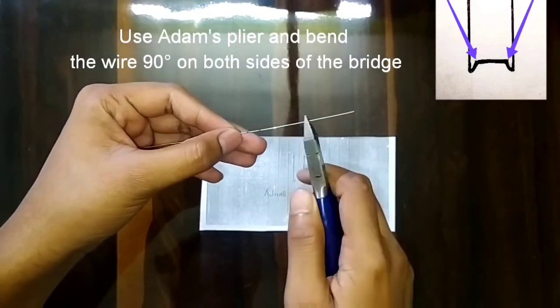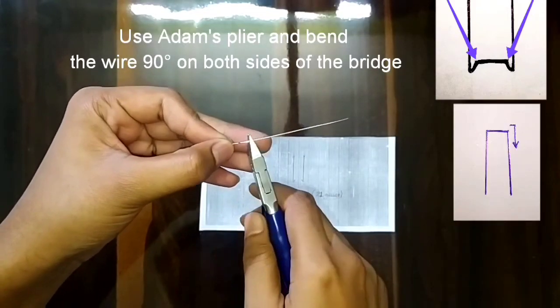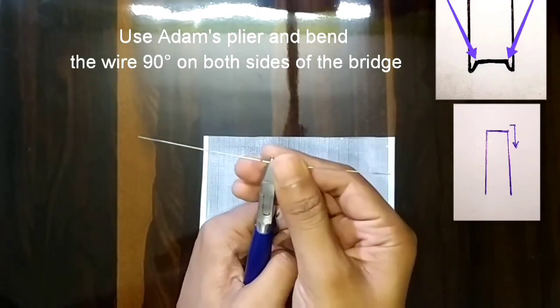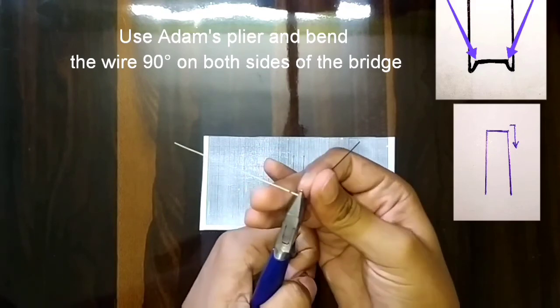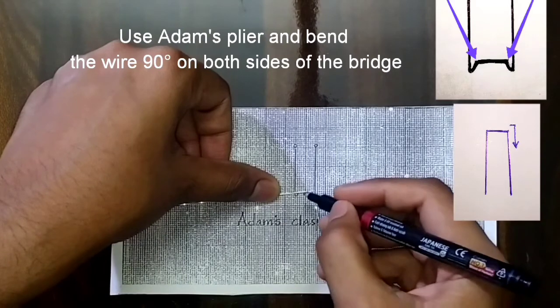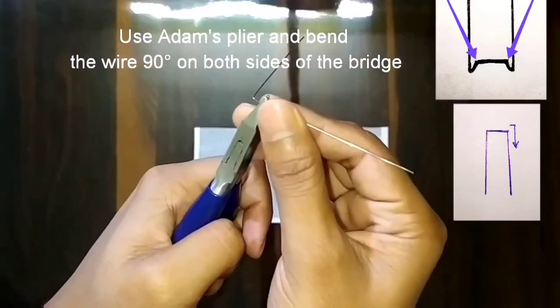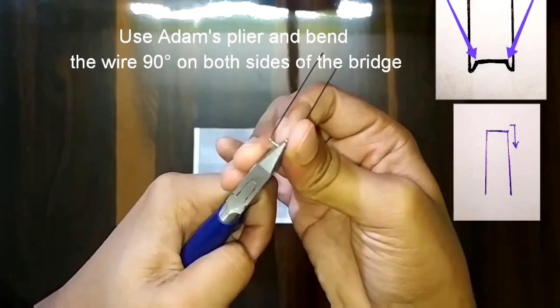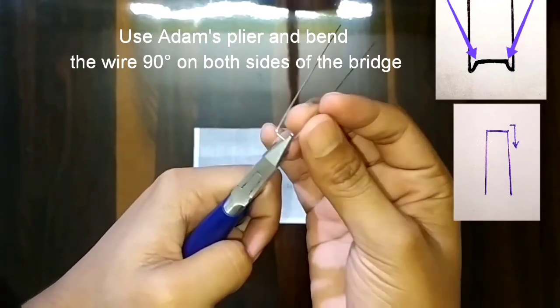With the help of the Adams clasp plier, I will give 90 degree bend to the wire in the downward direction as shown in the figure. Give the bend on both sides of the bridge. Try to give sharp bends.